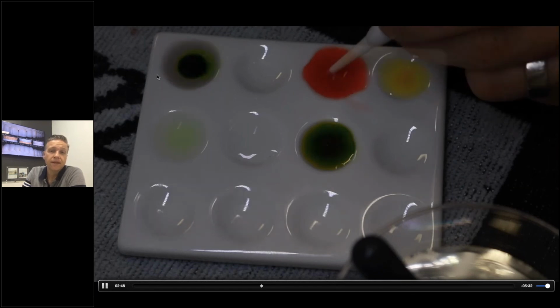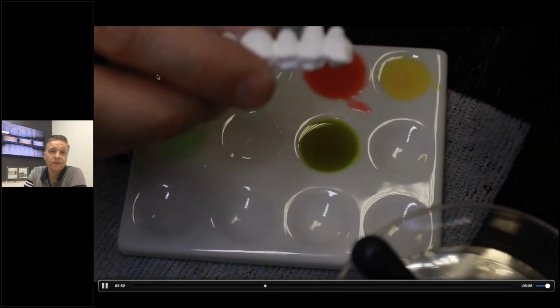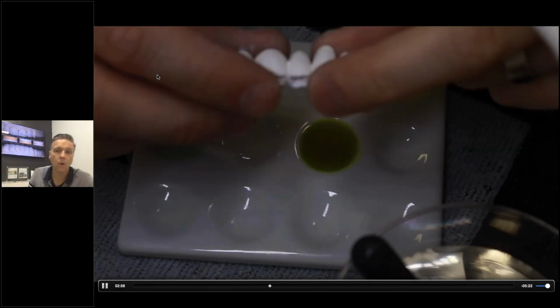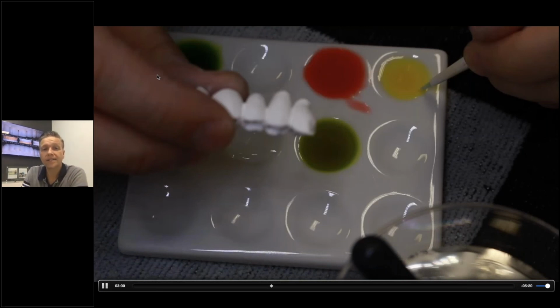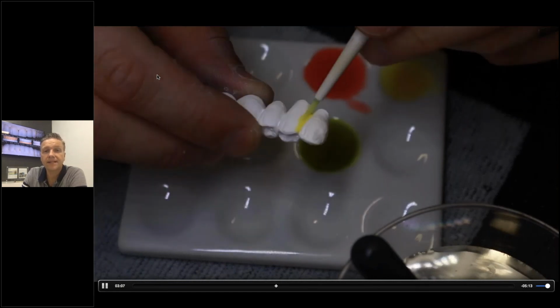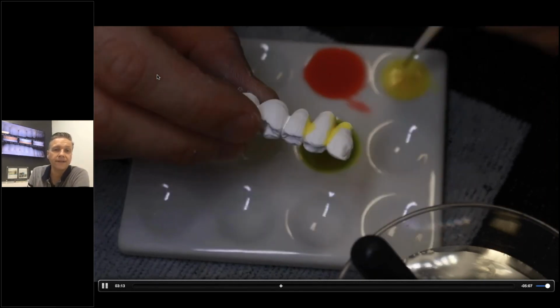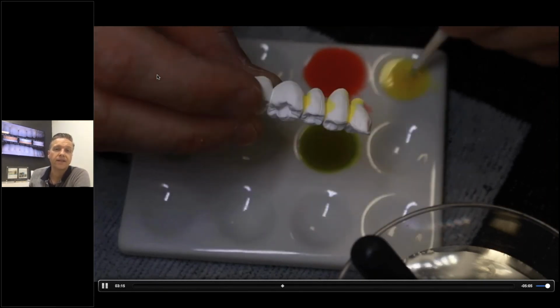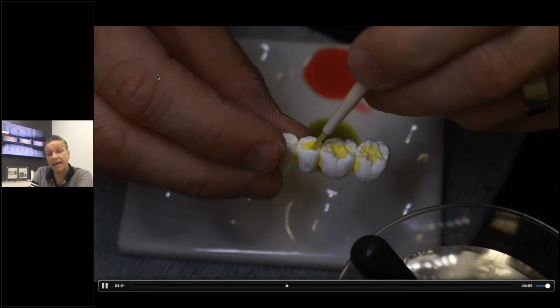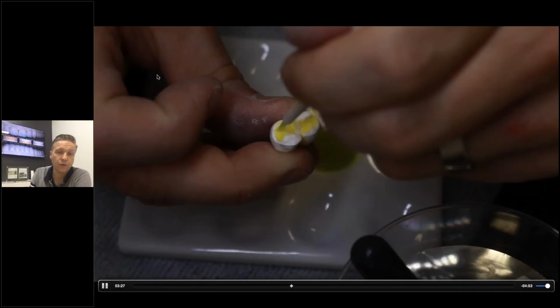After mixing all the colors, I start painting the colors on my framework. Here's the 600 bridge again. Usually I start with the dentin, going one time over the body, or in the proximal first with the darker dentin and on the neck. With the colors, it gets more prominent the more you go over the same area. Here on the occlusal area with the darker dentins, for example, if I want to reach an A2, I use A3 for my occlusal areas, for the interproximal, and for the neck, the cervical area.